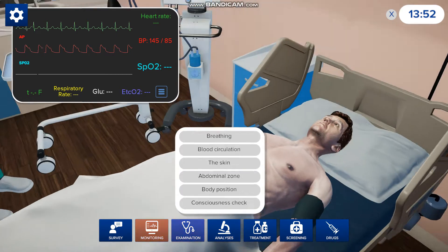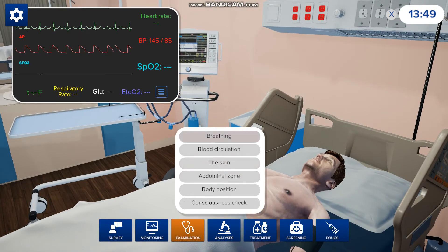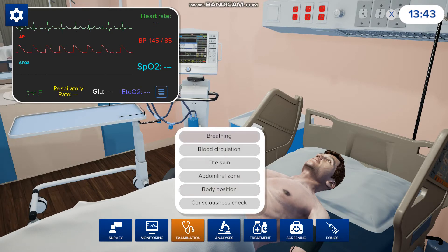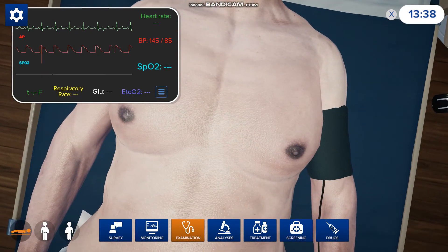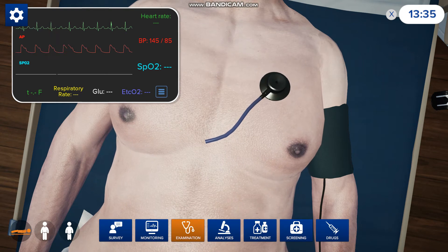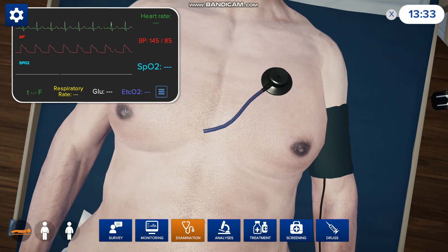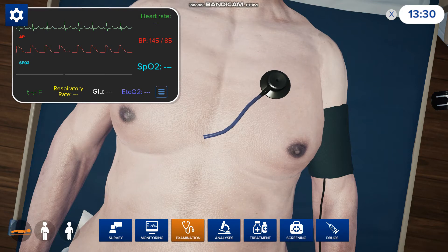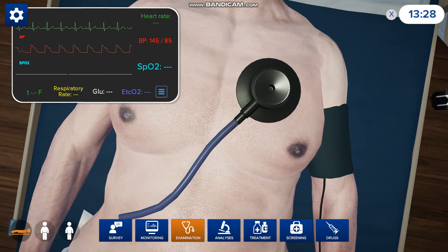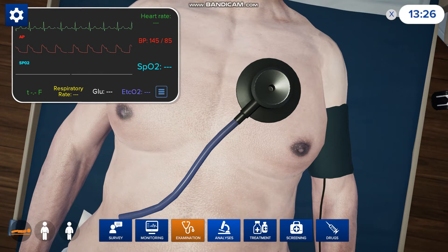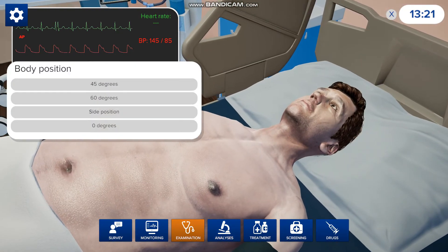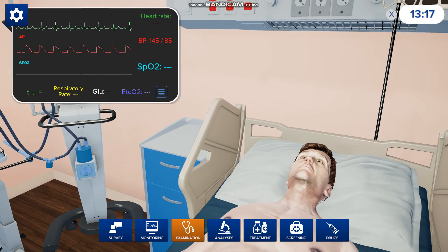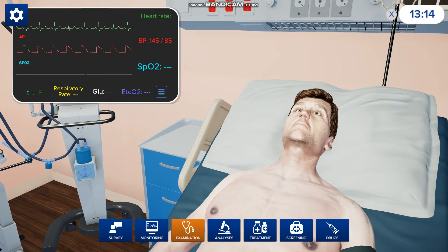When you want to do an examination you can check the skin, you can do breathing, blood circulation, abdominal zone, body position, and all the other stuff. When you press breathing you can do auscultation of the lungs — just press where you want to listen and you can hear him breathe. Depending on where you put the stethoscope determines what kind of sound you'll hear. You can also change the body position; if he's laying flat and you want him to sit up, you can change it and he'll sit up at whatever angle you choose.